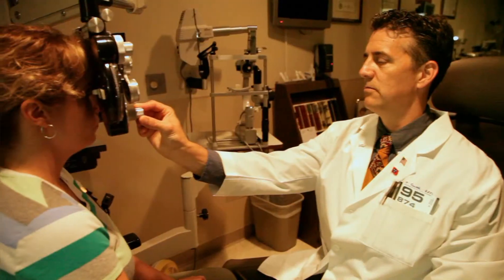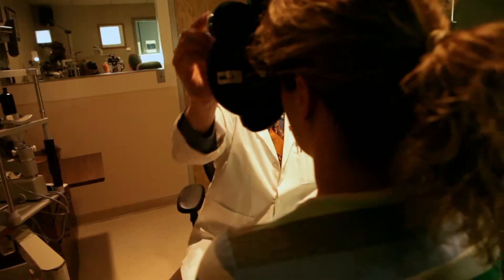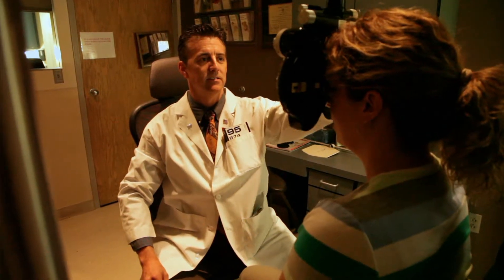That's the funny thing when the doctor keeps saying 'which one's better, one or two?' and you go 'I don't know which one's better' — but that's important because that's what we use to write a glasses prescription and really see how well someone can see. After the refraction, they'll check to make sure that your pupils are working and that your eyes can move back and forth and all around.